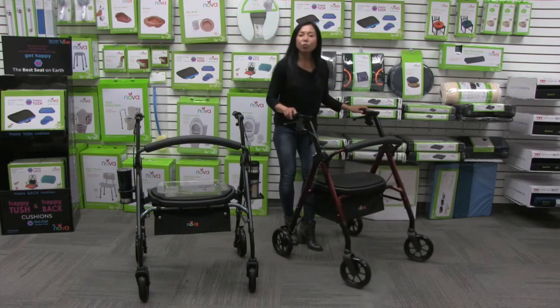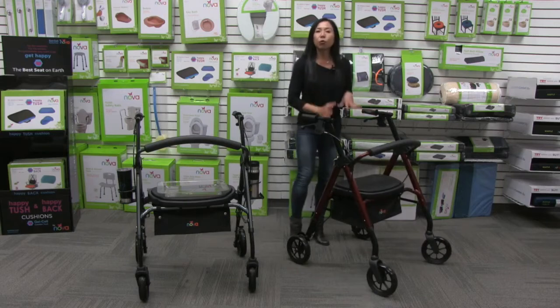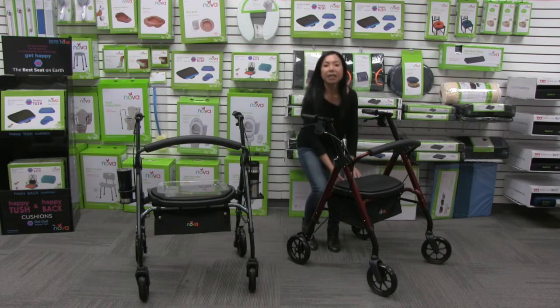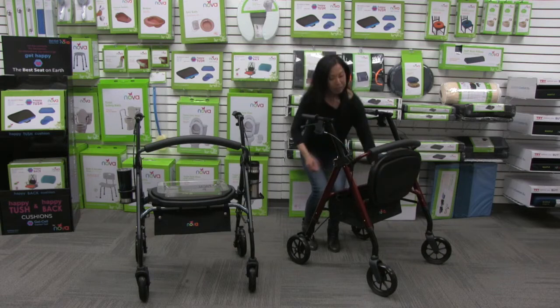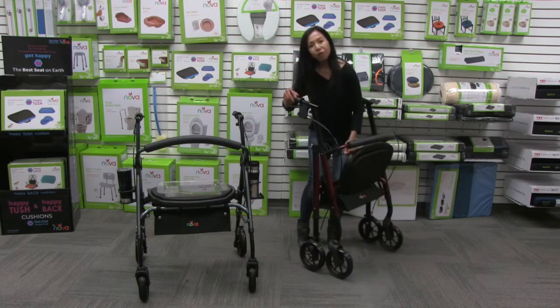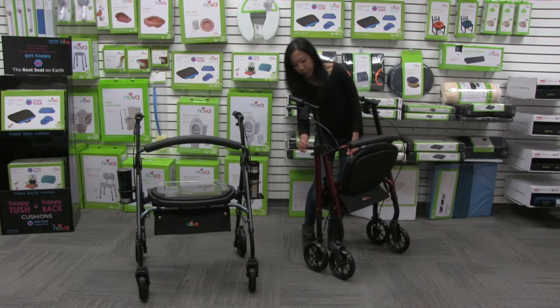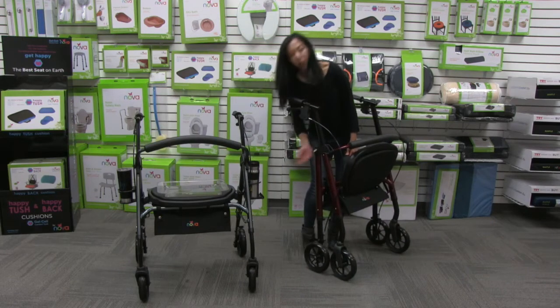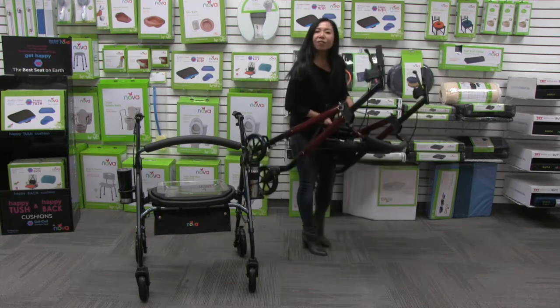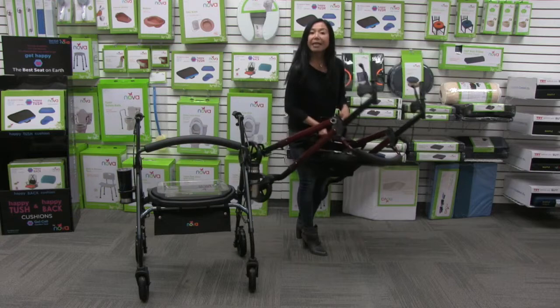The Star 8 comes with our lock and lift feature, which allows you to fold it in a locked position. All you have to do is lift up the seat and you'll see a carry handle — pull it up and you'll fold the walker. There's a pin here that you release and insert all the way through. Now I can pick up my Star in a folded, locked position, making it so much easier to get it in and out of my car.